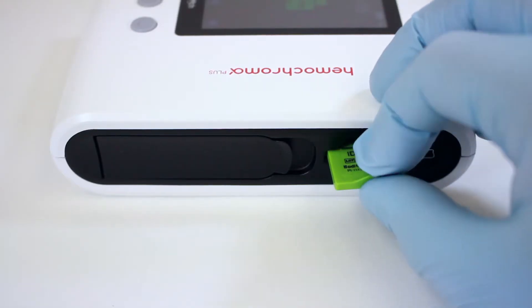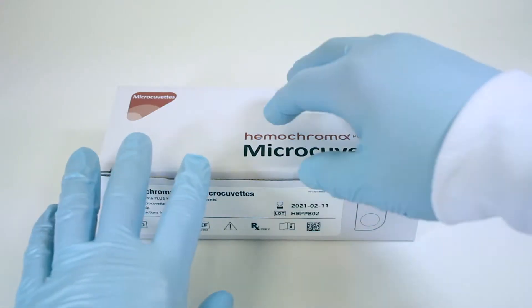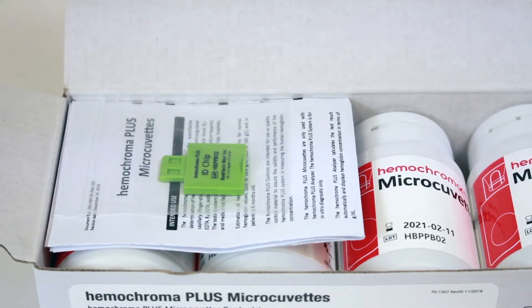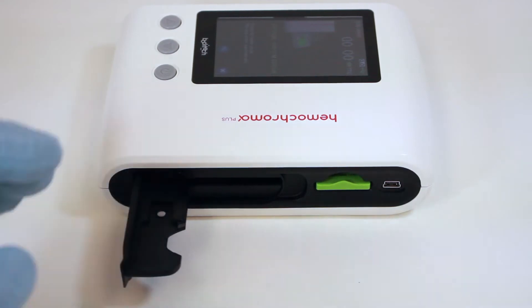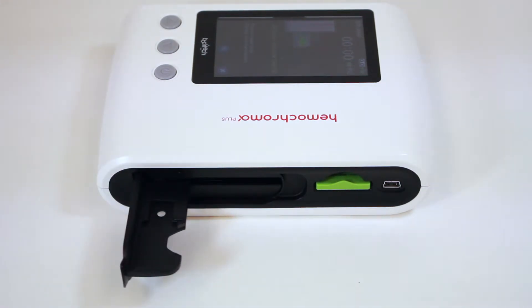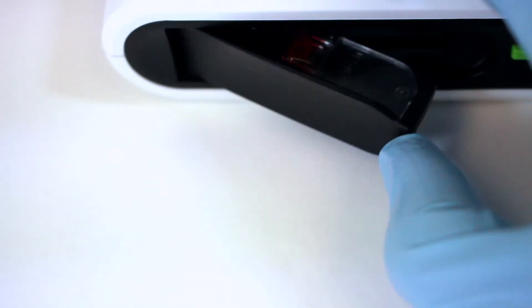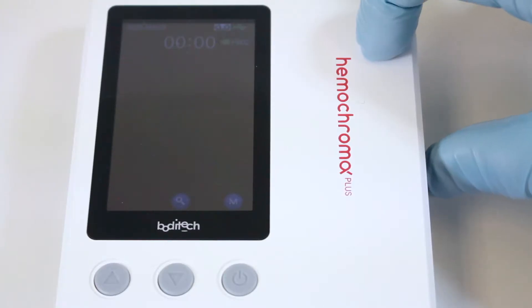Running a test. Insert the ID chip in the ID chip slot of the analyzer. The ID chip is provided in the microcubit box. With a finger, open the microcubit holder located on the right side. Insert a sample-loaded microcubit in the holder and close the holder completely.